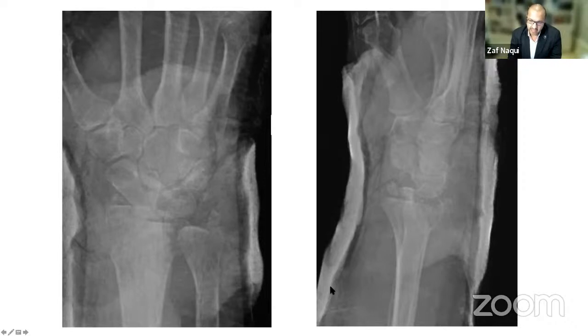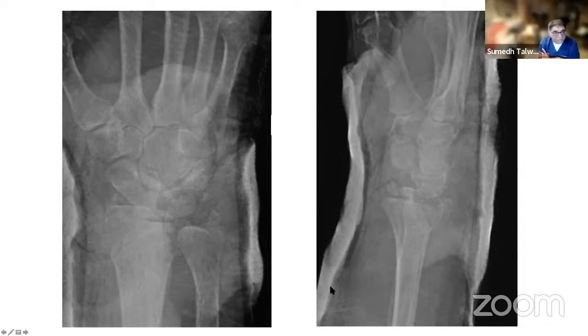Yeah. And the more I think about it, wrist fracture is probably the right way of thinking, so we consider everything. In this situation, on the lateral, the radius, you may think it kind of looks like a radius. You know, there's a little bit of it gone distally, but the carpus is telling its own story here, isn't it? It is, yeah.